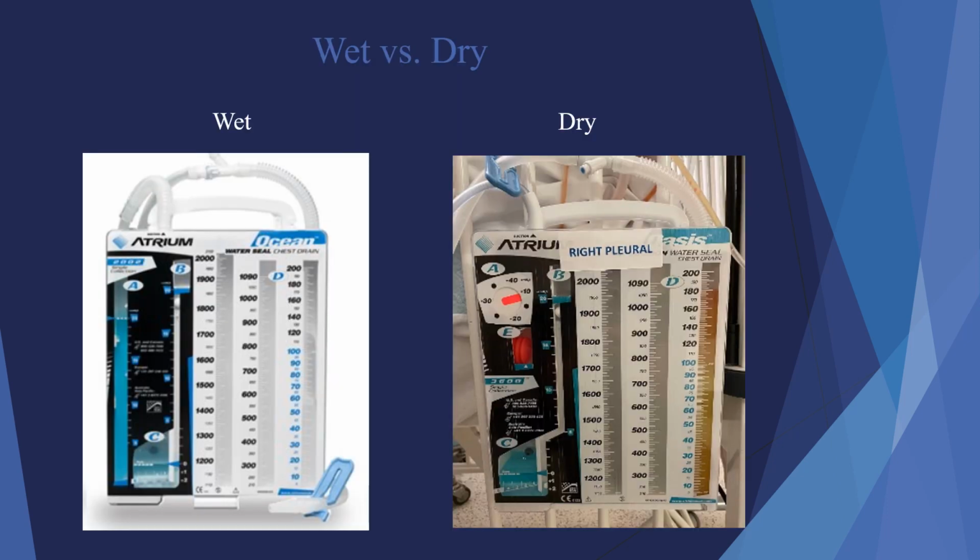And this is now what we have. Those three bottles are now all contained in these units. So now we can actually look at modern day chest tubes and have a better understanding of what's going on here. At least I hope. All right.